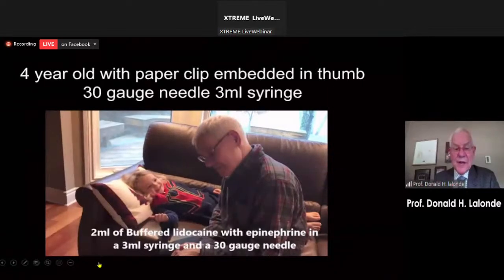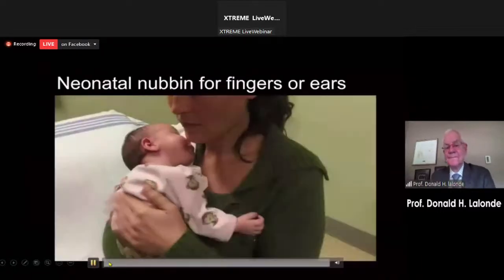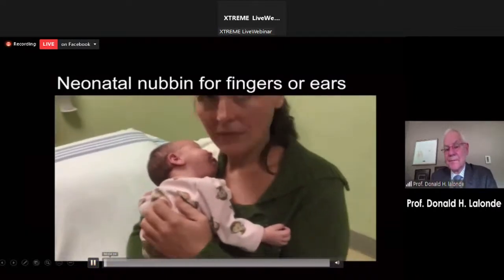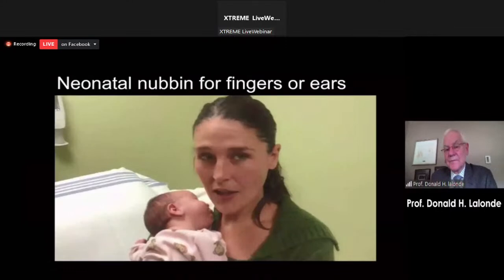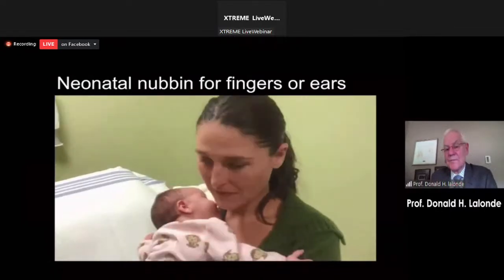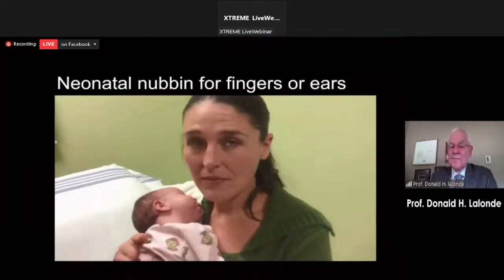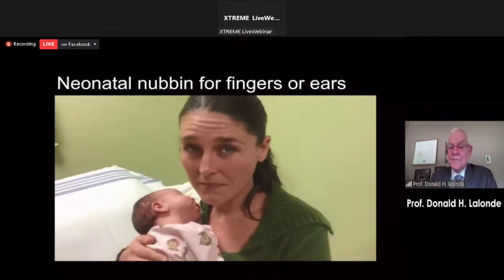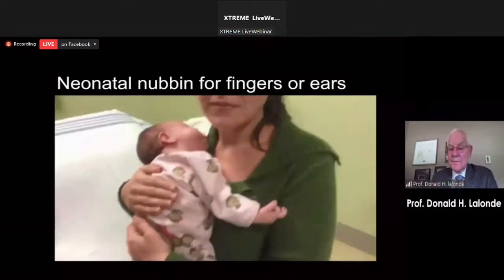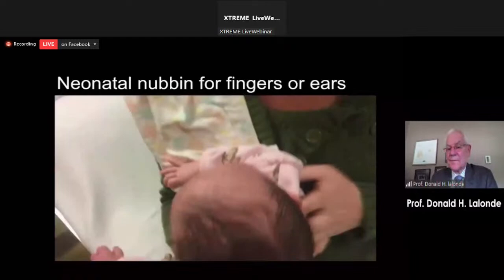This is for a neonatal nubbin. So it's 15 minutes ago we put freezing in? And how much did the baby cry when I did? None, not a tear. So we had you feed the baby, and she had just started, maybe a minute, 2 minutes. And then I just pinched the finger, put a 30 gauge needle in, and she's asleep now. Is she or not really?